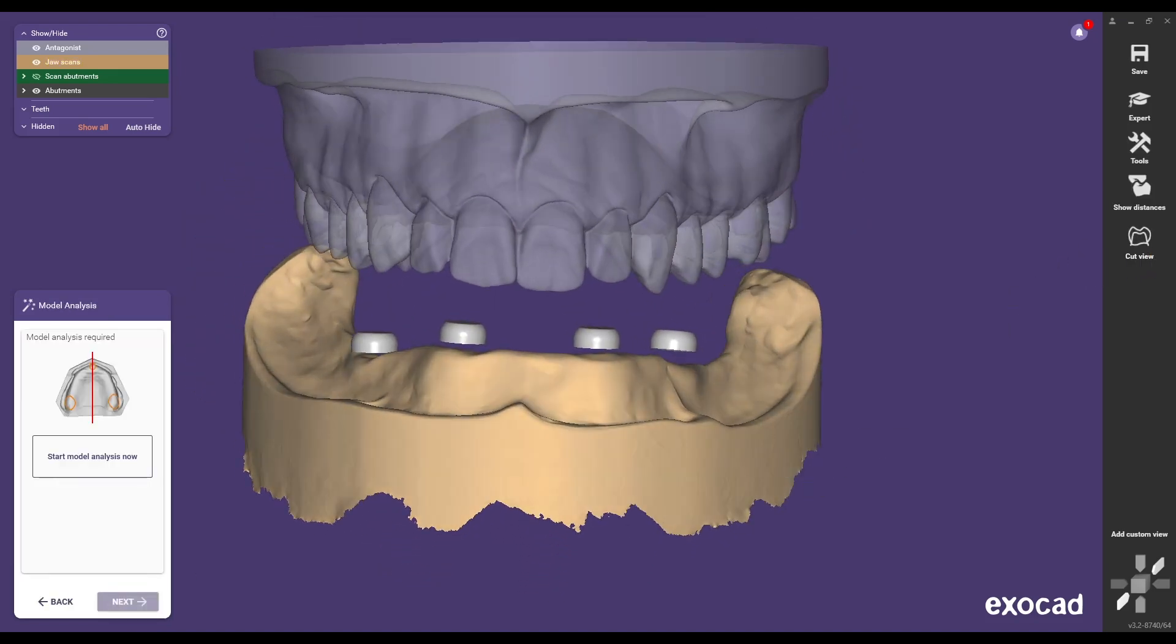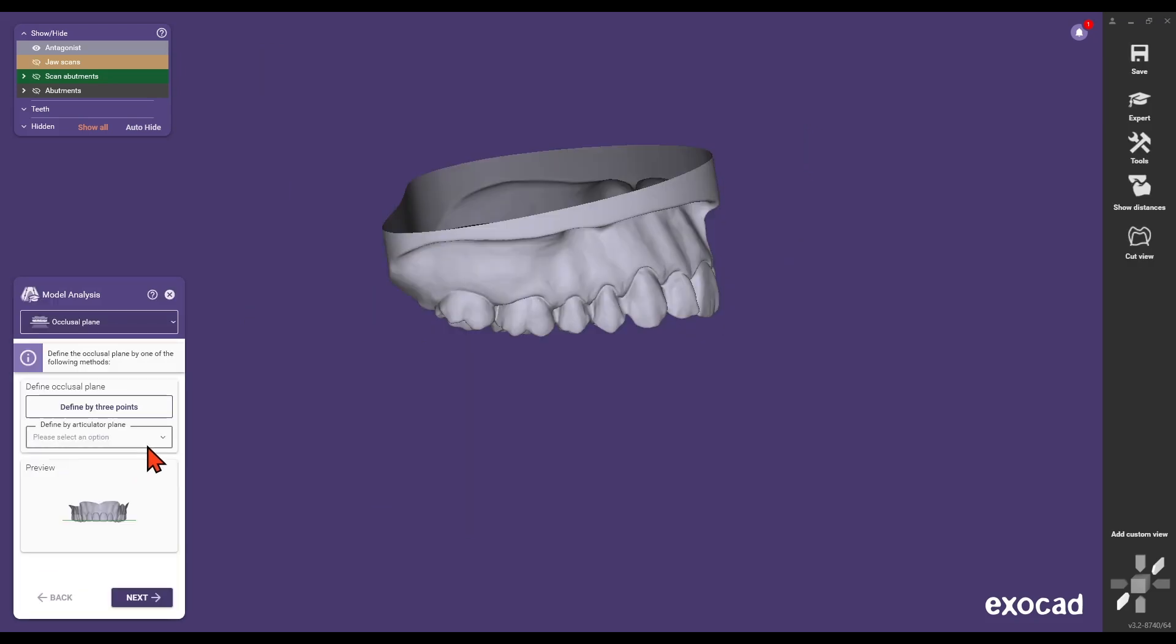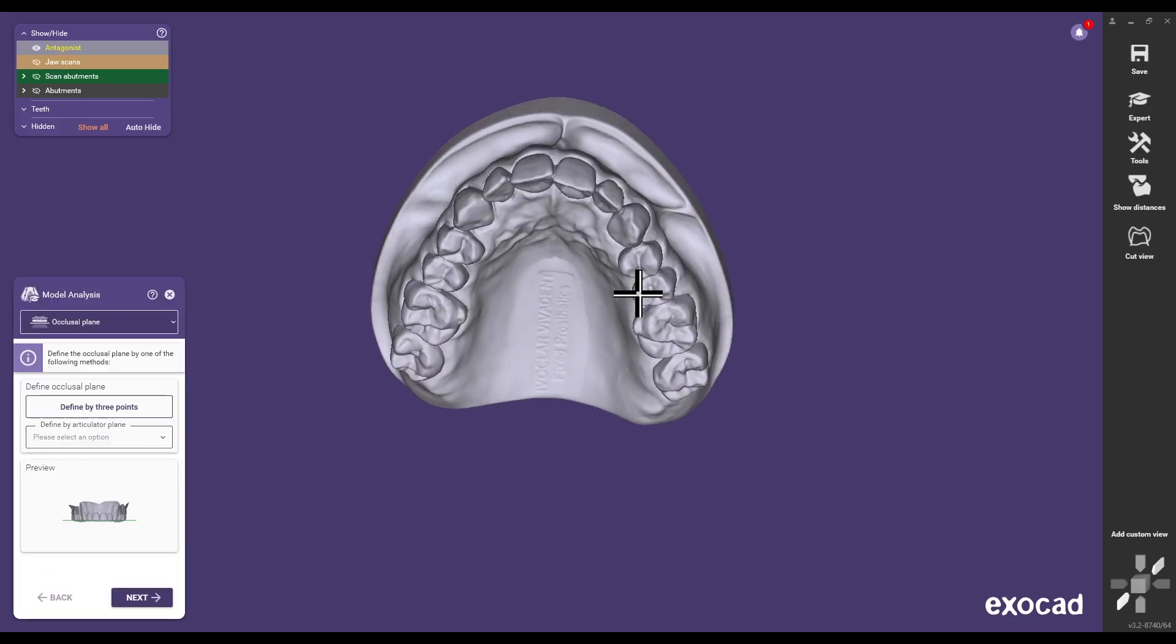Begin the model analysis of the antagonist jaw. Follow the step-by-step instructions in the ExoCAD assistant. Mark all tooth positions in the antagonist jaw.